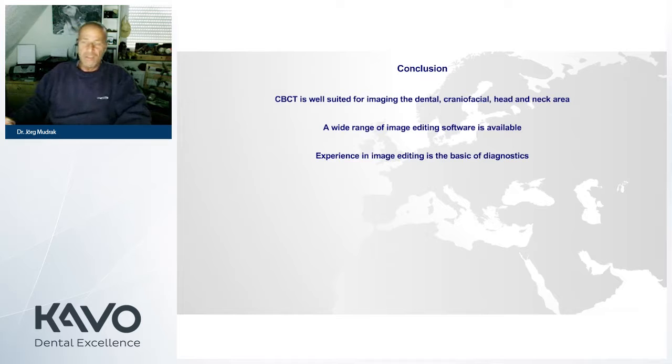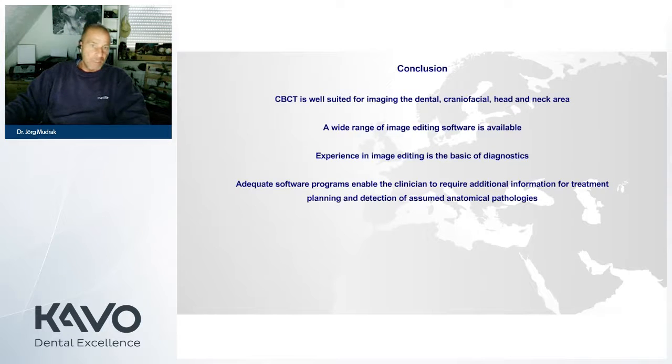Putting this webinar together, I learned a lot again. This is really an option where you have to check the internet and check books, so as not to mix up diagnoses. We need adequate software programs that enable us to get additional information on the assumed anatomical pathologies. And of course, I thank you very much for your time to join this webinar, because education and knowledge must be improved.